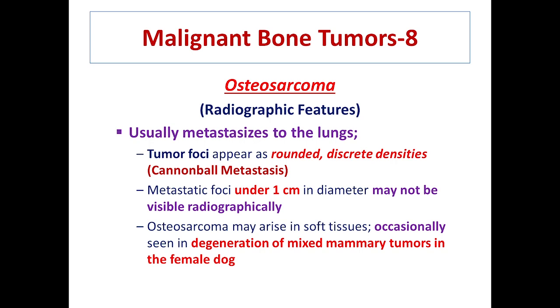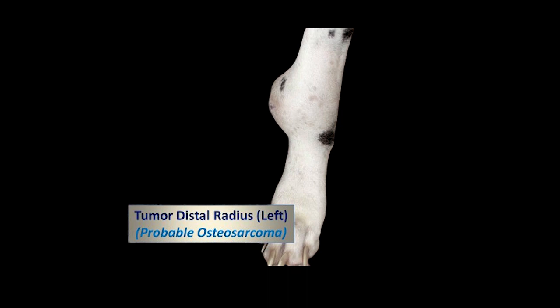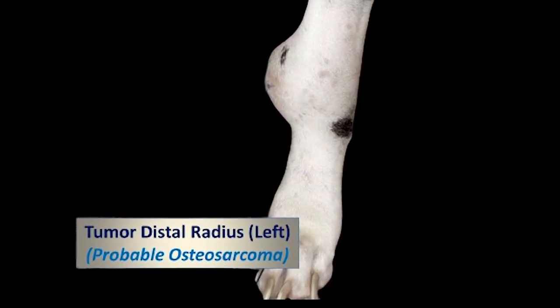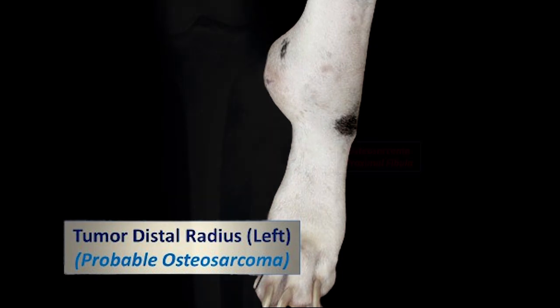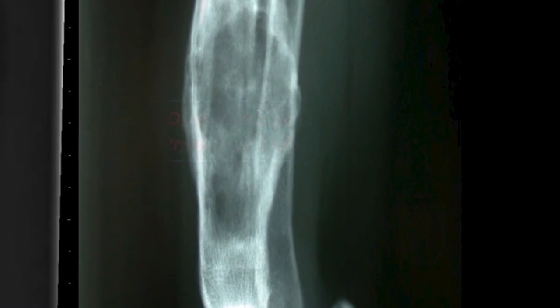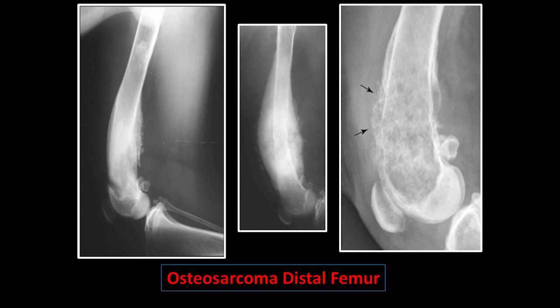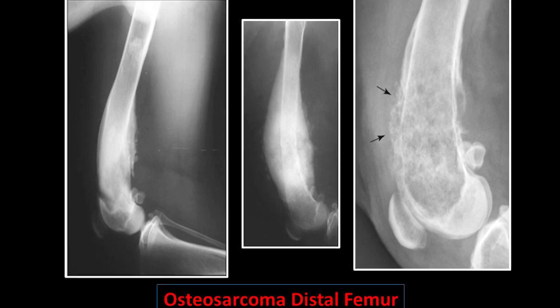Osteosarcoma may occasionally arise in soft tissues, such as in degeneration of mixed mammary tumors in female dogs. In this picture you can see an outgrowth in the distal radius of the left side that may be osteosarcoma. This is the proximal fibula involved in mixed-type osteosarcoma. You can see osteoblastic or osteolytic changes at the affected site. This is osteosarcoma of the distal radius in which lytic changes are very clear. Histopathology should always be recommended for confirmation in such cases.